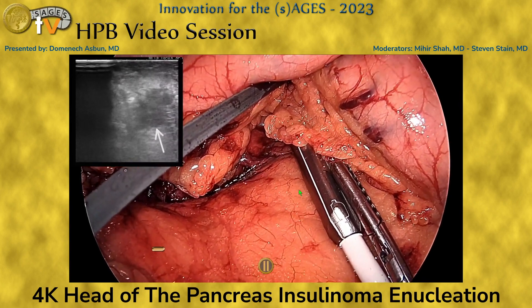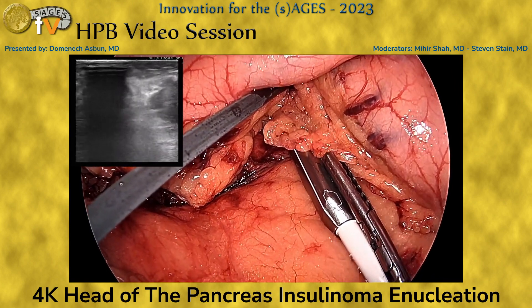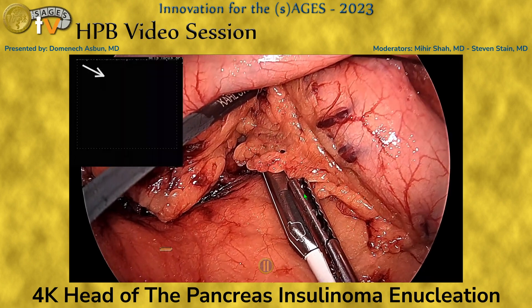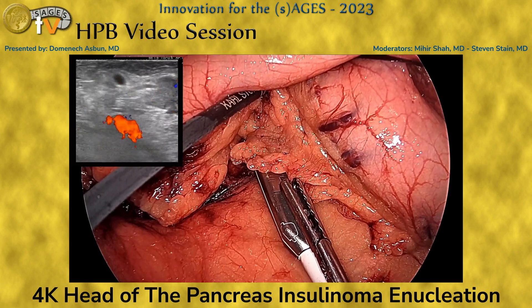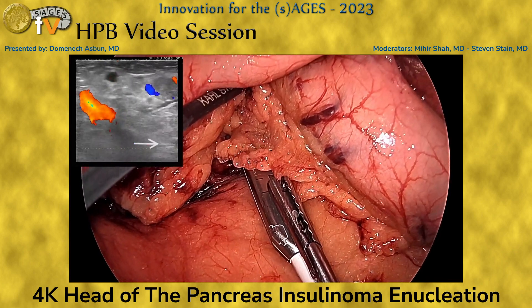We then proceed with ultrasound identification of the lesion, which we confirm is near the GDA — you can see the GDA there — but still something that can be enucleated. It's also far from the pancreatic duct, which is identified there as well.